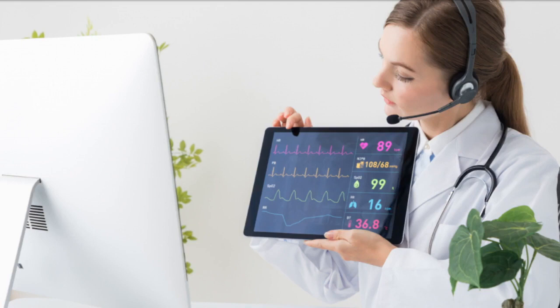During this welcome call, we will show the user the special features that are offered so that they know that they are never alone. We also check and verify after 3 days that the user has uploaded their test results to the internet. If not, we communicate with the user to verify that the equipment is working correctly and that they are testing.